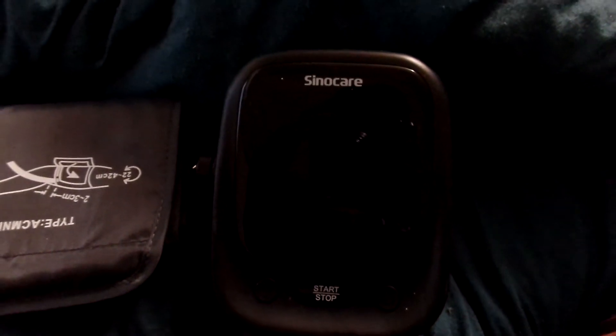Hi, it's Renee and welcome to my YouTube channel. Today's review is on this blood pressure monitor.